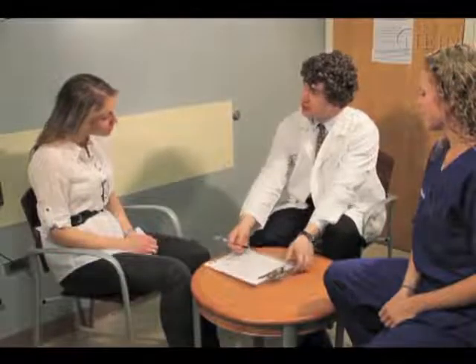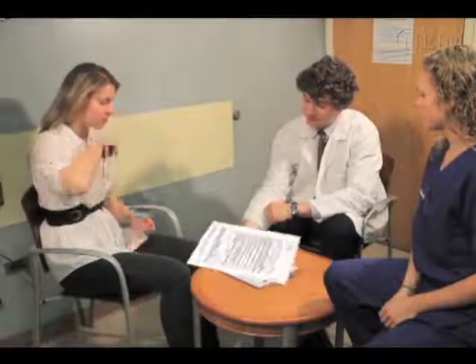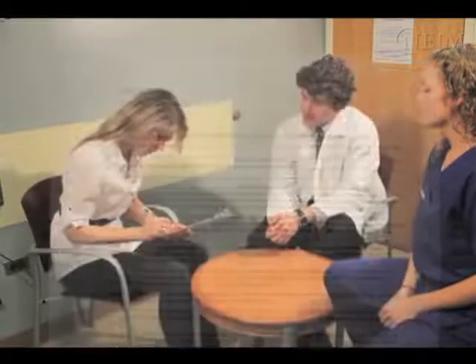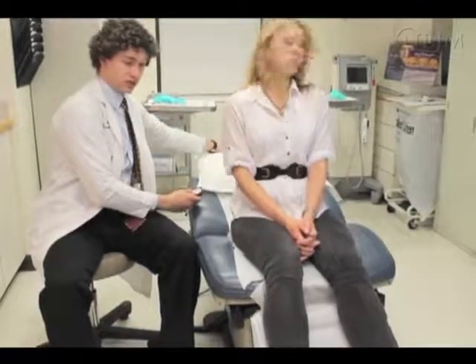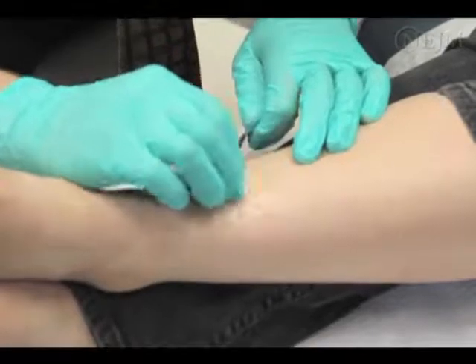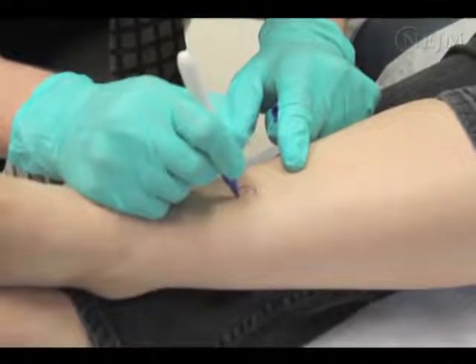When performing any medical procedure, it is important to educate the patient regarding its indications, risks, and benefits. After answering any questions or concerns the patient has, formal written consent must be obtained. Following appropriate timeout protocol, verify the biopsy site and side with the patient. Have the patient recline on the examination table to allow good visibility of the site and easy access to it. Begin the procedure by cleaning the area with an alcohol swab. If the lesion is poorly demarcated, it can be outlined with a skin marking pen before the procedure.